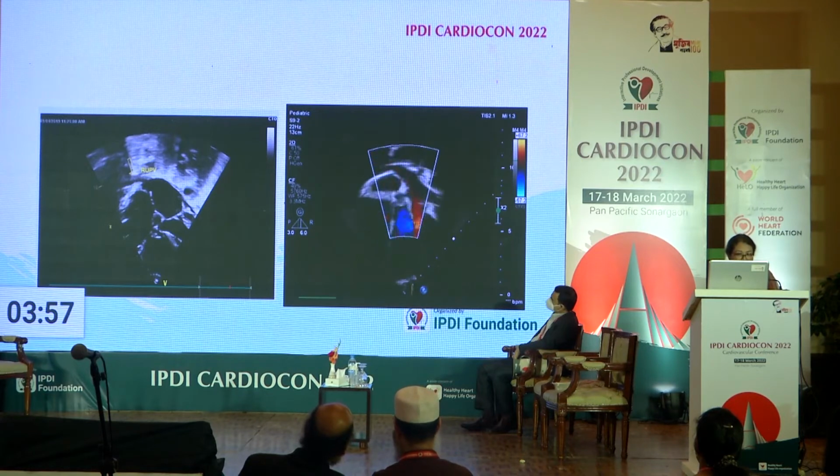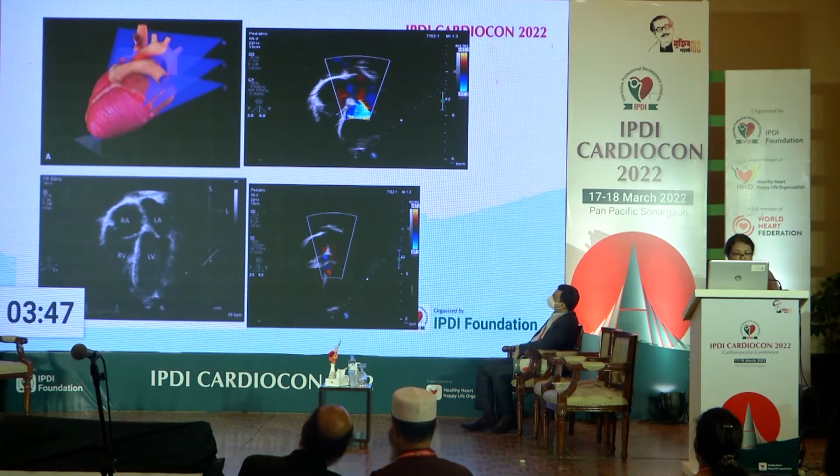On color flow interrogation, we can see an oblique jet entering the LA towards the lateral mitral annulus. So from the apical four chamber view and the near apical five chamber view, we are able to identify the right lower and upper pulmonary veins very easily.